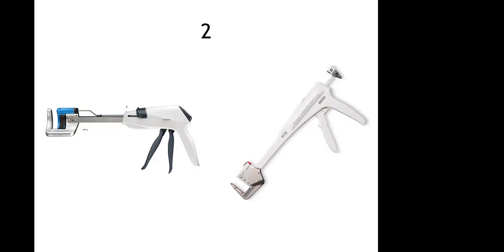And then how do you achieve the anastomosis? You have already seen the device for that. It is done by an end-to-end anastomosis circular stapler. Okay. Now, what is the use of the second one? Name one thoracic operation where you have used or seen this. You can use it in VATS, sir. VATS is video assisted thoracoscopic surgery.